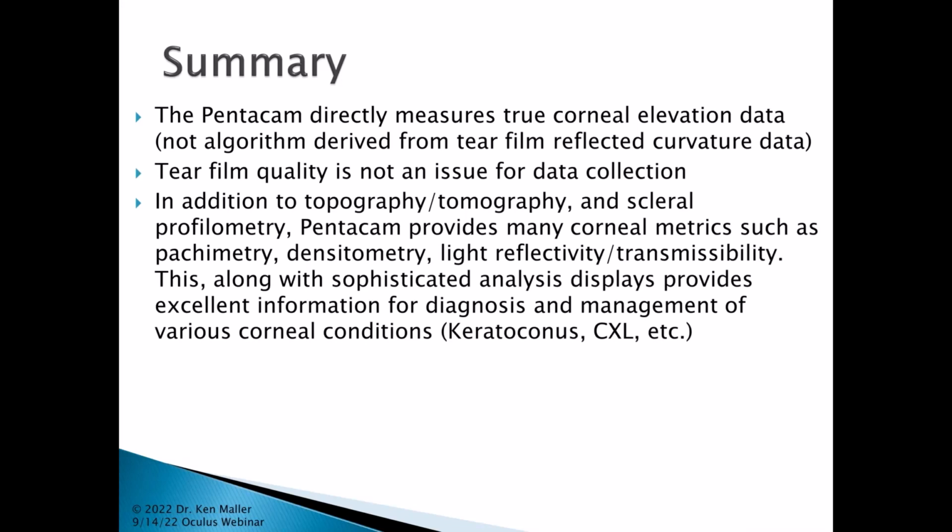And in addition to the topography and tomography, scleral profilometry, the Pentacam provides many other corneal metrics such as pachymetry, densitometry, light reflectivity, and transmissibility. This, along with the sophisticated analysis displays, really gives you excellent information for diagnosis and management of various corneal conditions, things like keratoconus or following cross-linking management, etc.